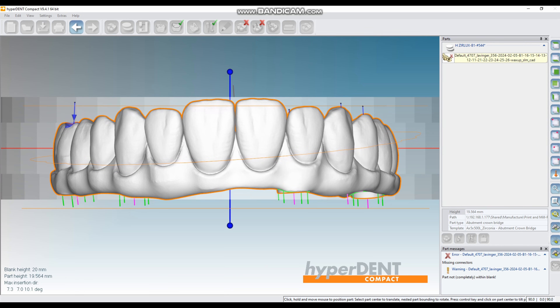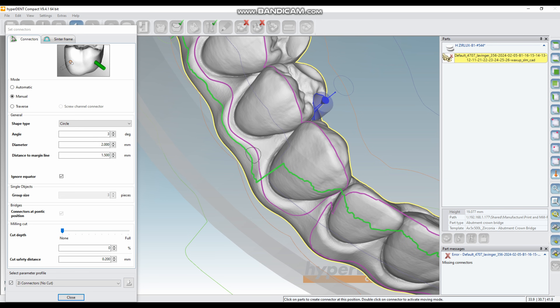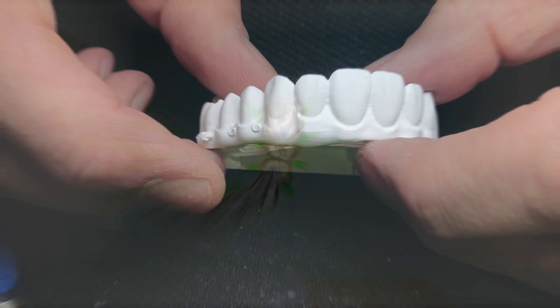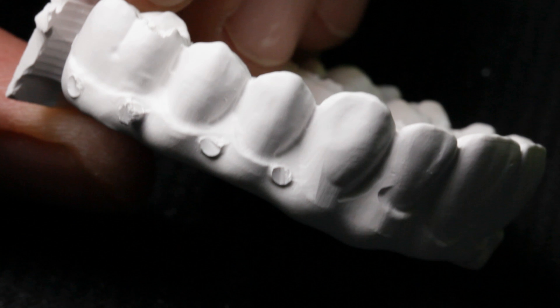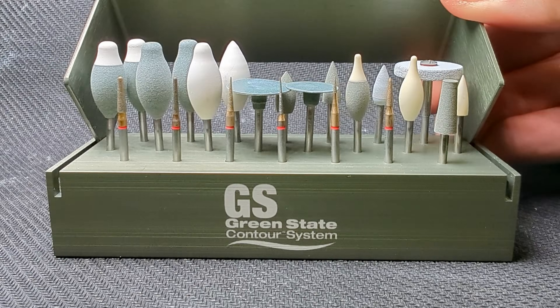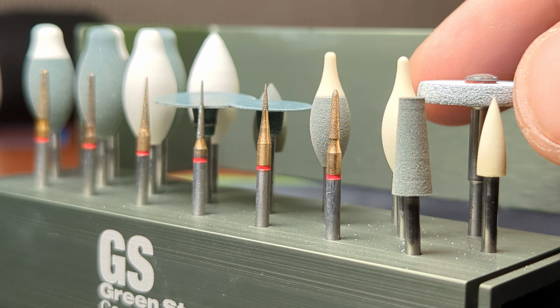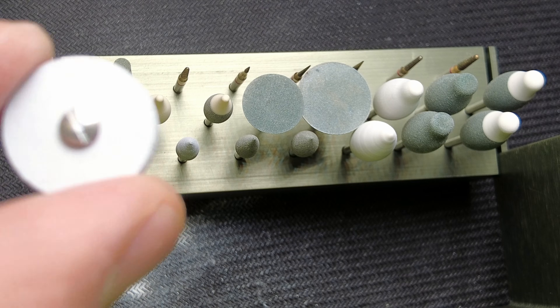I am milling all zirconia full-arch cases in a C-clamp with marked high-definition areas to reduce the green-state contouring process. Green-state contouring is the most critical step and I am using the Wagner Toolkit to contour all my zirconia cases. I make very few adjustments to the sintered zirconia.